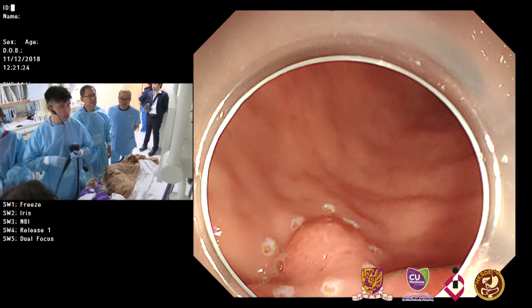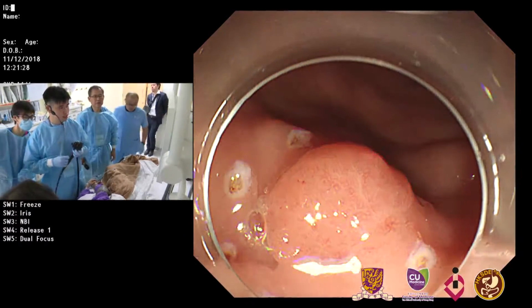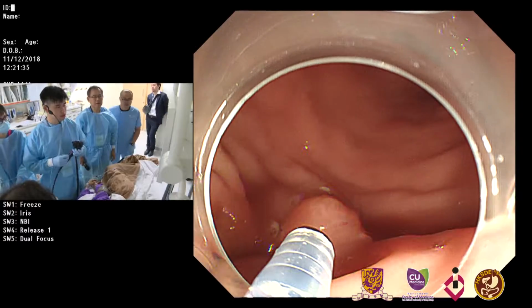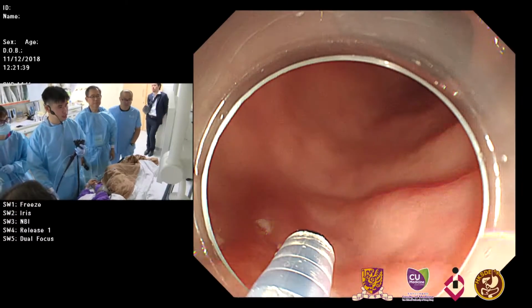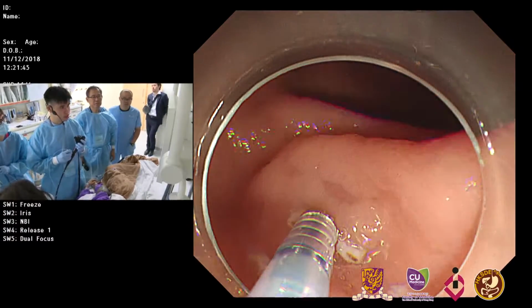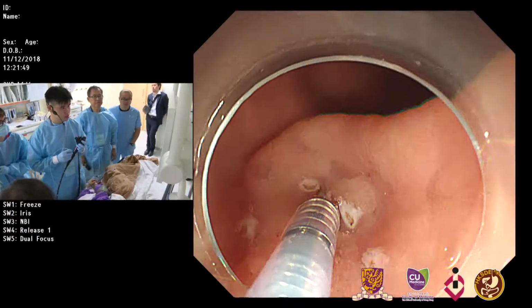In lesions that are located distally, you can always start the dissection from the oral side to the anal side, because gravity will automatically help you to elevate the lesion and create the traction that you need. Okay, needle out. Inject. More.